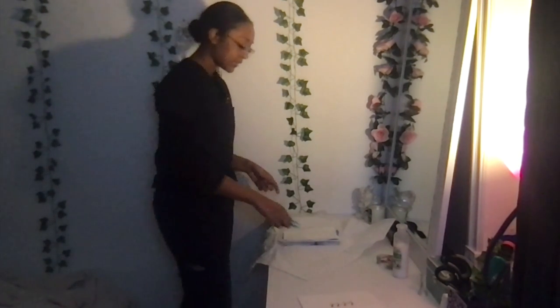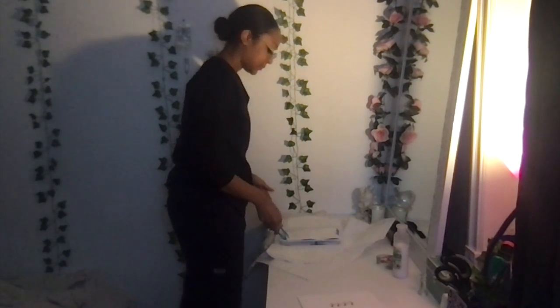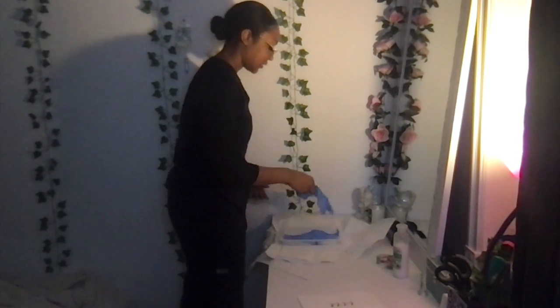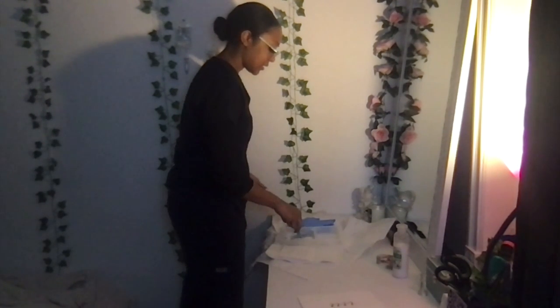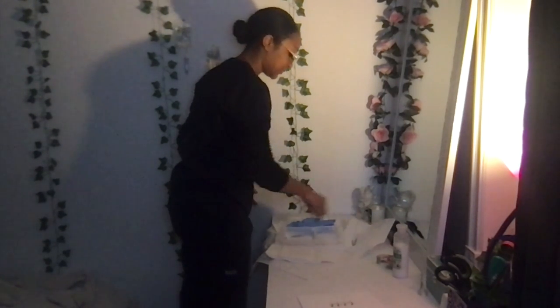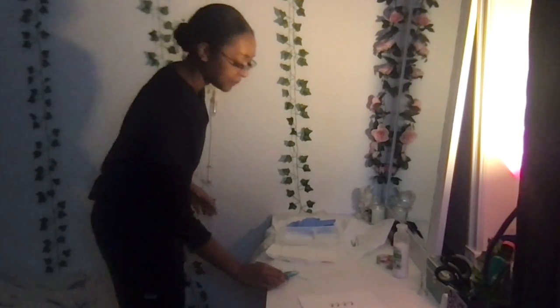Then I can take everything out with these tongs. This is the drape, sterile, aseptic gloves, and then my sterile tweezers. My dressings are still going to be left in there.